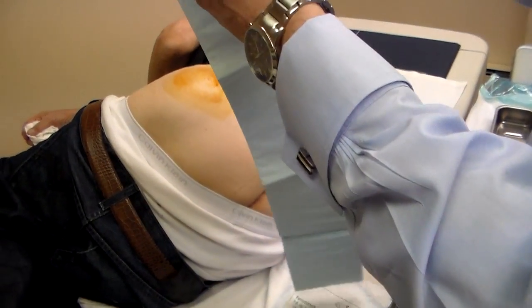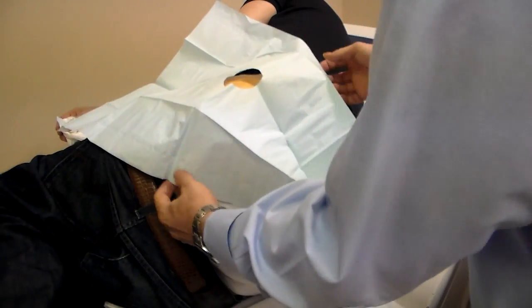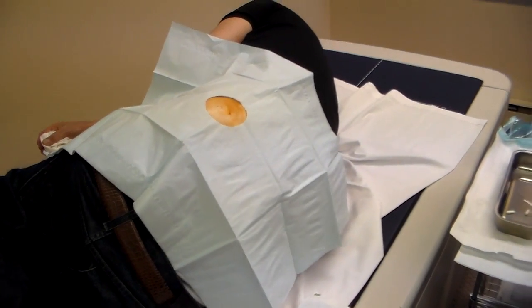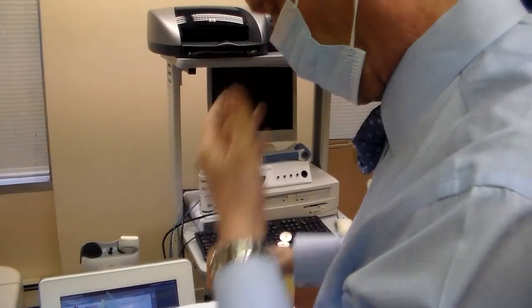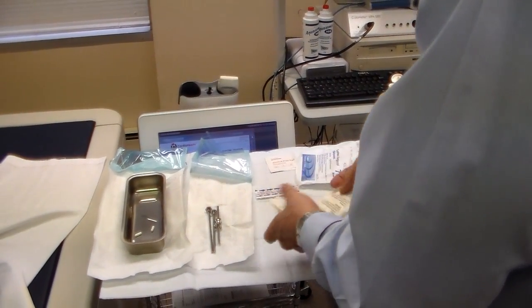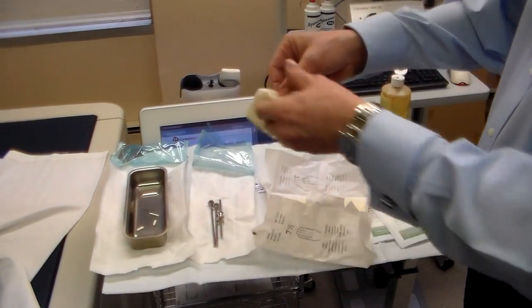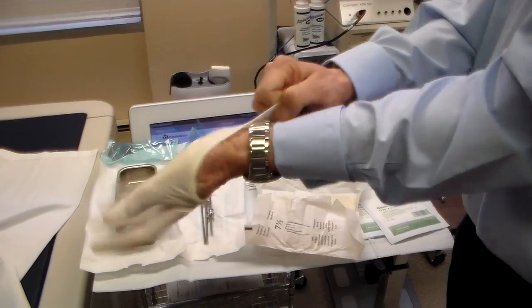We take the fenestrated drape and overlay it on the area that's already been prepped, then apply our face mask. Now we're ready to go. You're going to see how we can do this without any assistance needed from a medical assistant. Putting your gloves on.